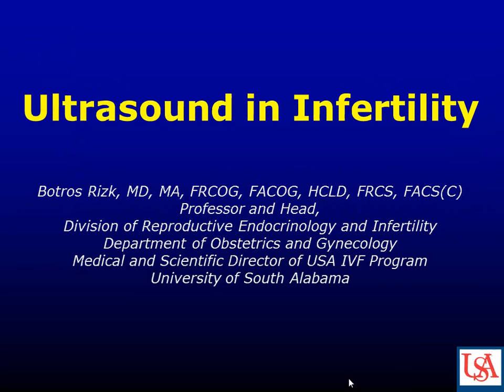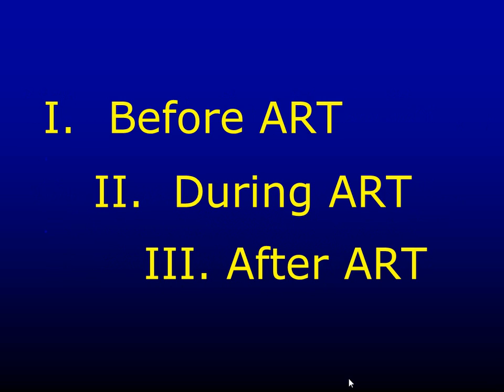This morning we're hoping to cover ultrasound in relation to fertility. So really I try to divide it into three components. Basically, how do you evaluate patients? What do you need ultrasound monitoring for? And the value of ultrasound in terms of outcomes, assessing outcomes and assessing complications.